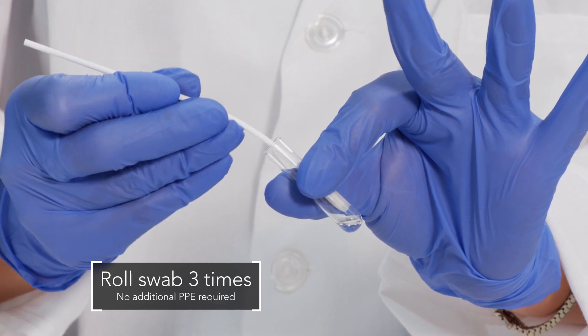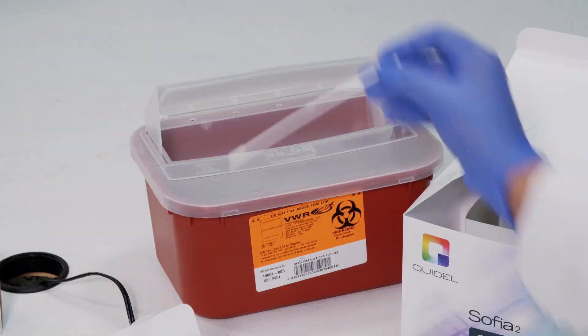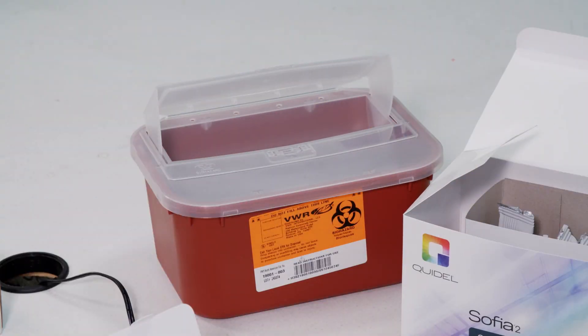To remove the swab, roll the swab head against the inside of the reagent tube as you remove it. Dispose of the used swab in your biohazard waste.